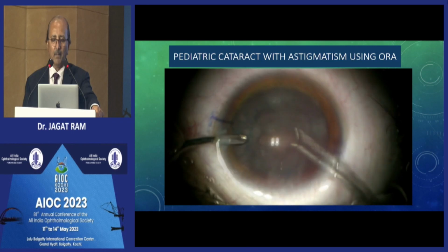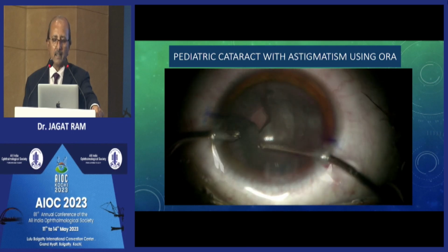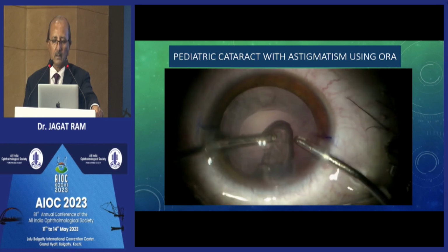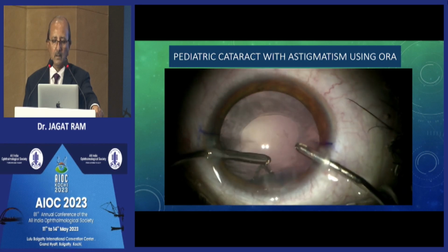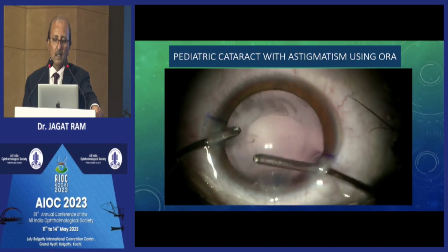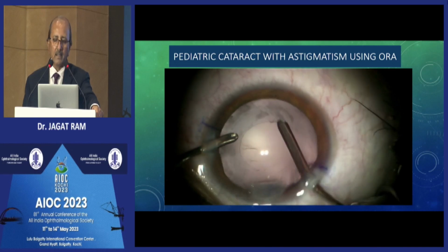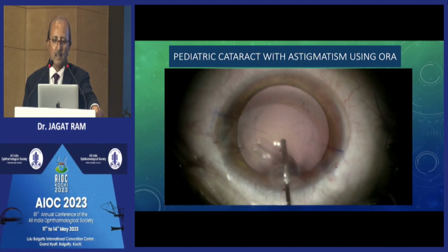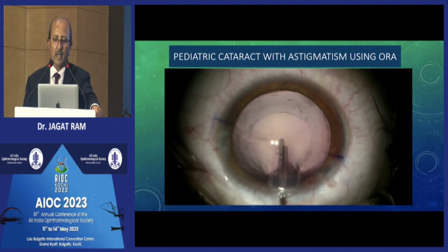Roughly, we have already marked the horizontal axis. After removal of the cortex, we fill the capsular bag and anterior chamber with viscoelastic.